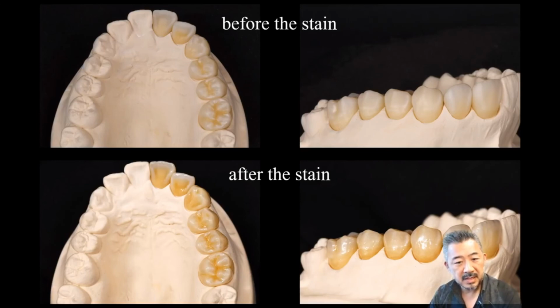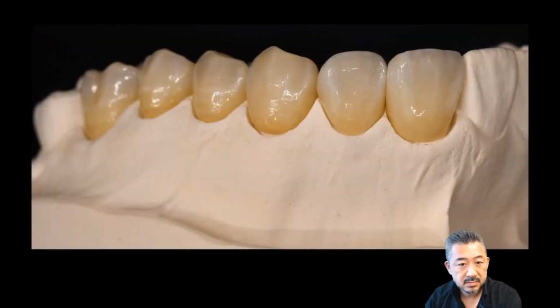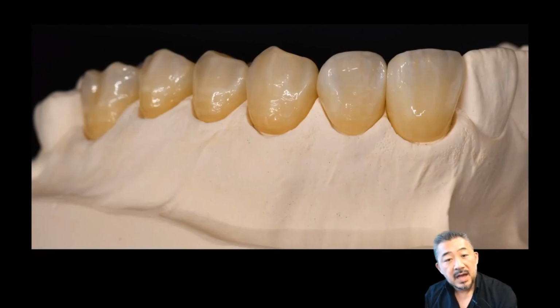This is because the multi-layer disc has a very good shade, right? Anyway, the shade is also symmetrical with the other side. I think I expressed the gradation of the crown, the transparency of the incisal edge and the white band, and emphasis of the marginal edges.